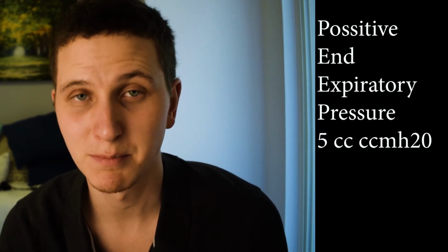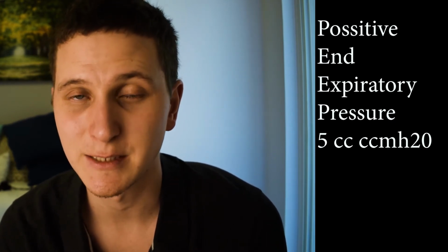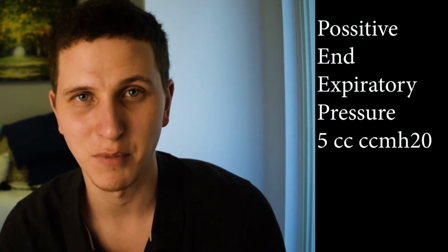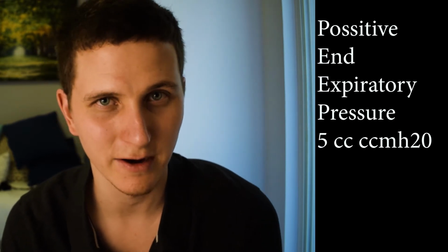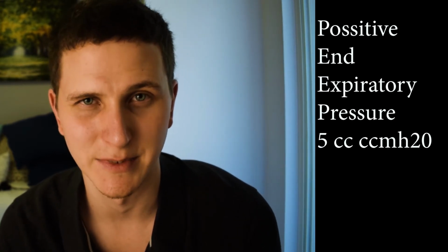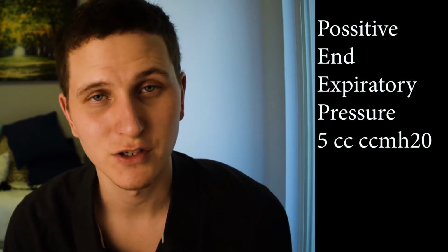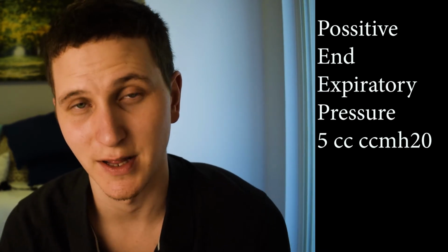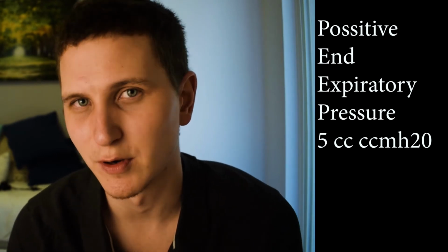The other setting you want to set up is your PEEP. PEEP is positive end expiratory pressure. So when I am finished breathing out, I still have positive air in my lung. Kind of like when you inflate a balloon and if you let out all the air in the balloon, it kind of flops over and it's empty. We don't want that in the lungs. So at the end of my breathing, I still have positive pressure in my lungs. That's PEEP. Normal is 5. That's physiological PEEP, meaning it's the normal PEEP in your lungs.